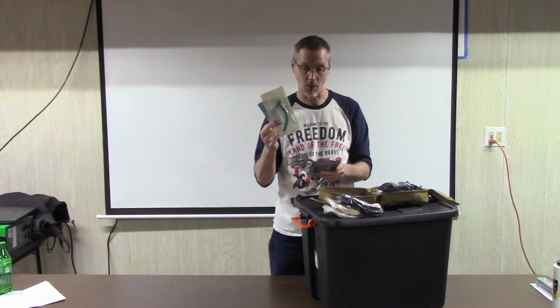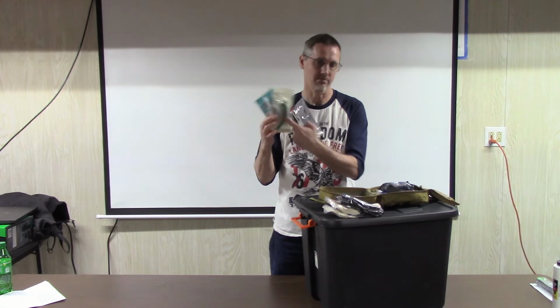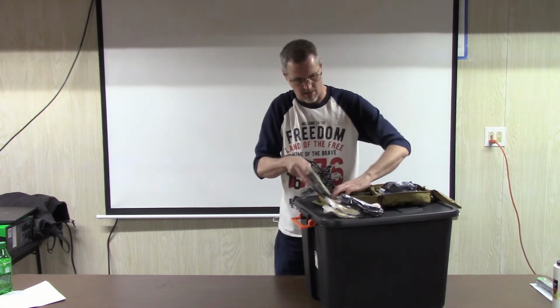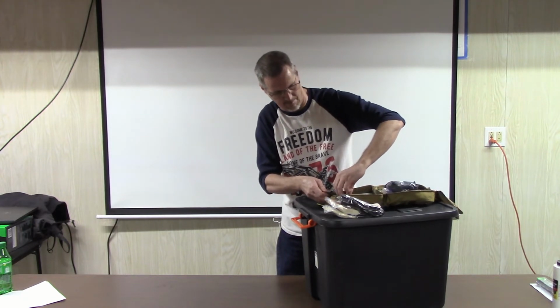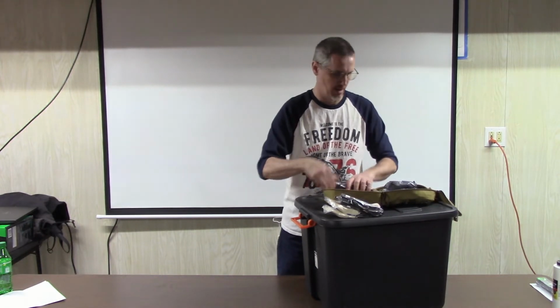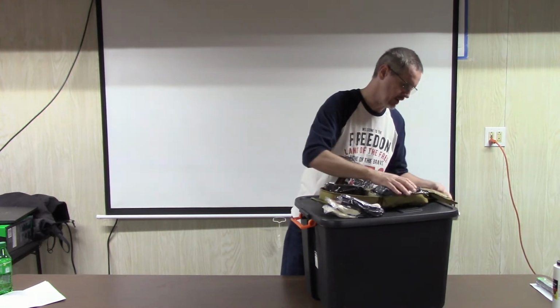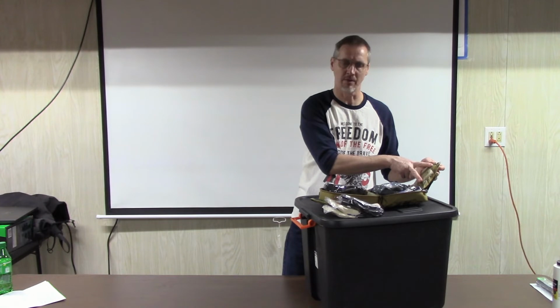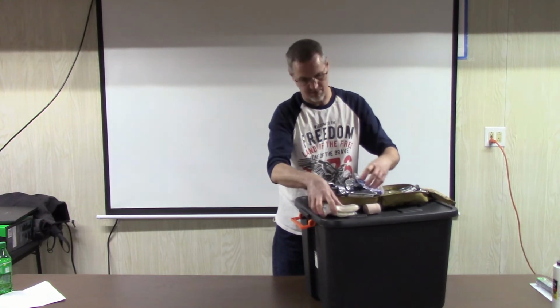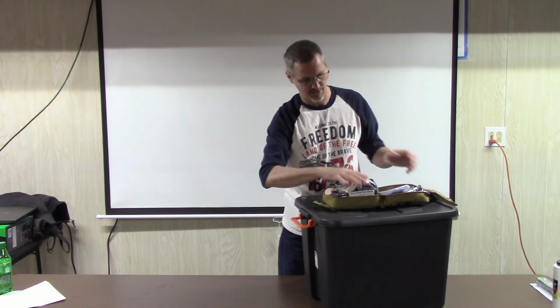There's the nasopharyngeal airway. This one was actually sized correctly, and it does have the lubricant attached to it. Chest decompression needle, and a good pair of the scissors in here, and there's just some basic first aid, some band-aids and some tape in here, and also water purification tablets. So like I said, you can see what's in this bag. If this thing comes out, things have gotten really bad.